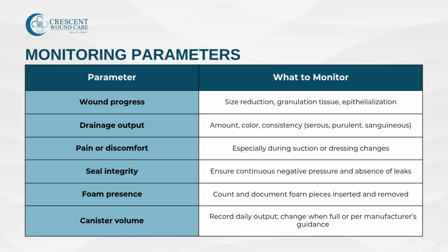Pain or discomfort: a sudden increase in pain during therapy may suggest complications like infection or vacuum pressure issues. Seal integrity: even a small air leak can halt negative pressure, so the occlusive dressing must be checked regularly.